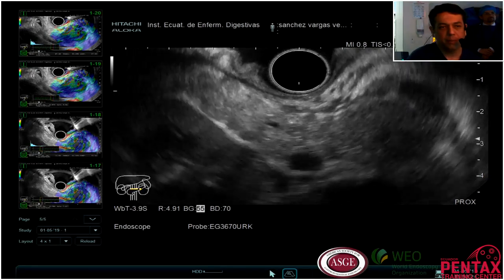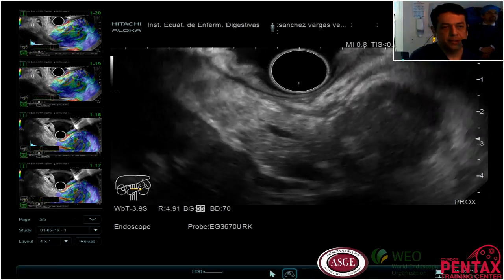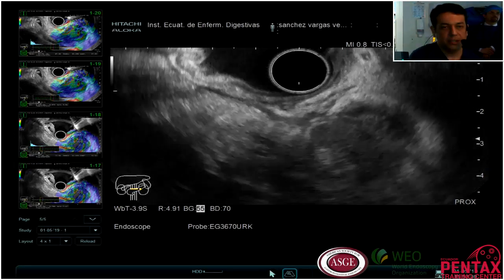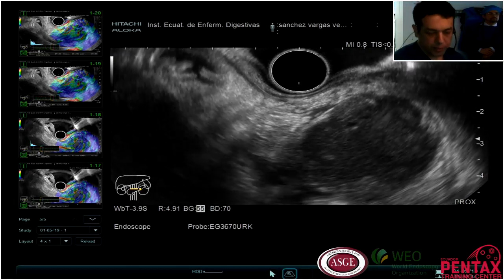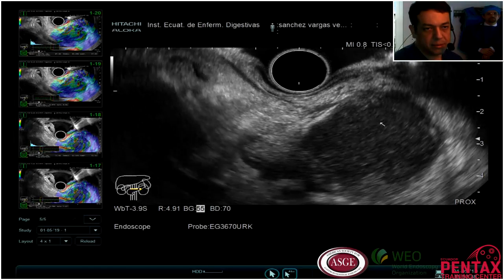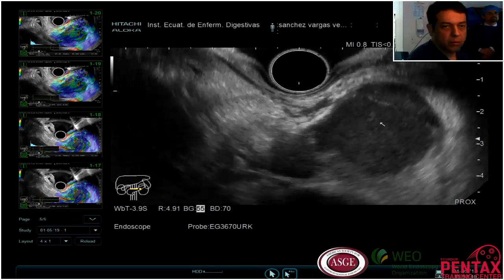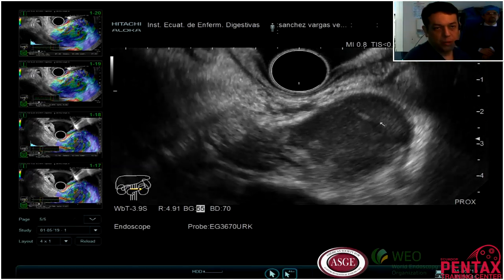I am at the level of the body of the pancreas, and I can see this area that could be a mass or could be a fluid collection. We really don't know. We need to evaluate very well first.